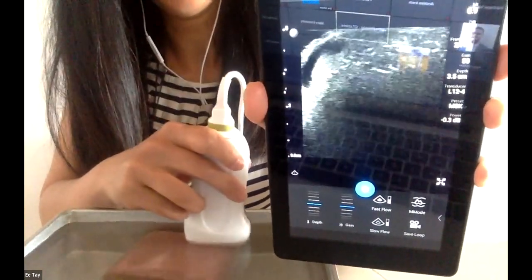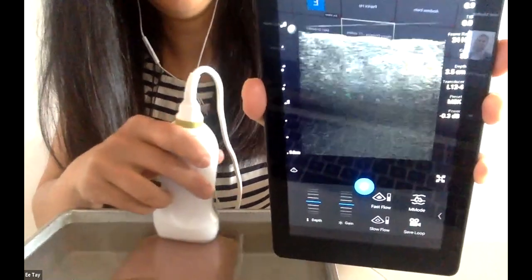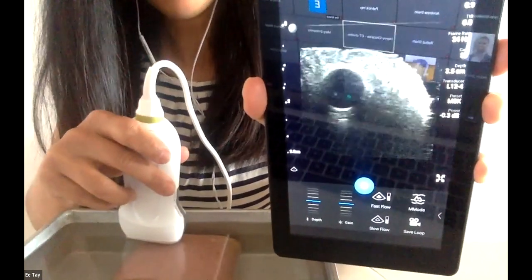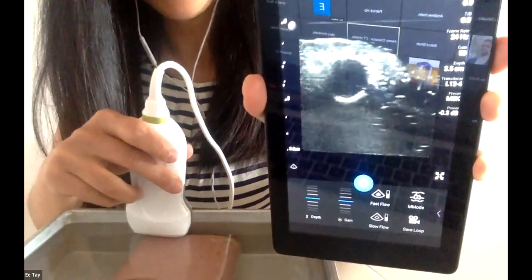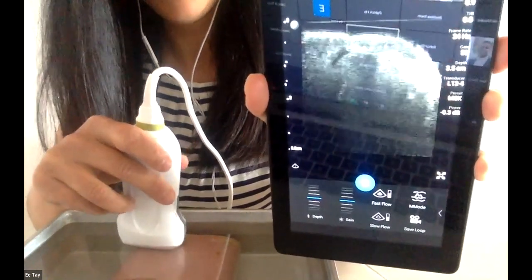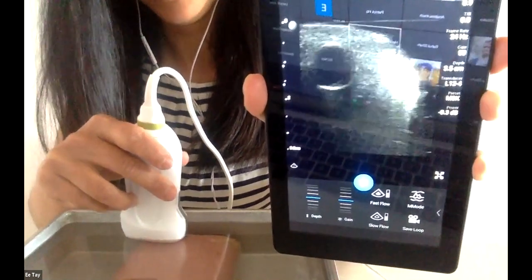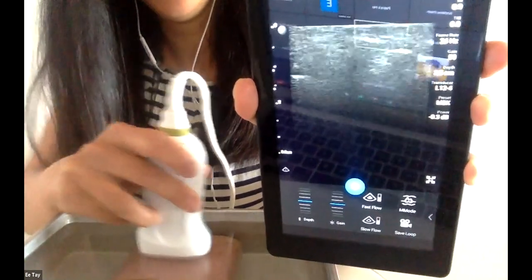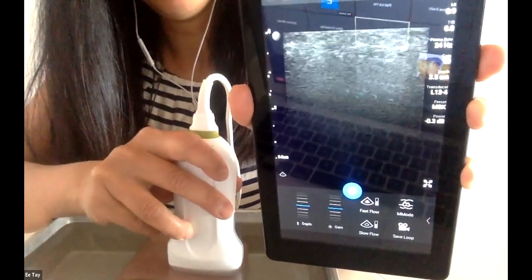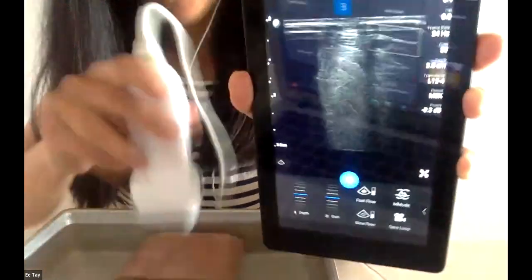It doesn't show up as well as the tofu, but I wanted to simulate. I tried to find natural abscesses for this particular spam, but since this is a cheap knockoff spam, I thought there would be more abscesses, but there really wasn't. So if you're going to do the abscess thing, just buy the fattier spam. I think there were more abscesses in the tofu, but anyway, I just wanted to simulate that for all of you, just for fun.